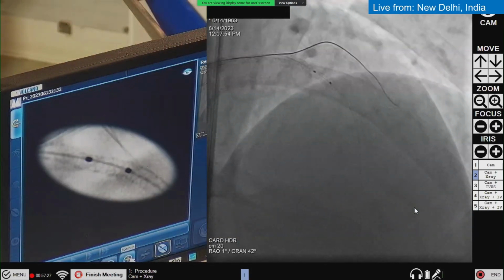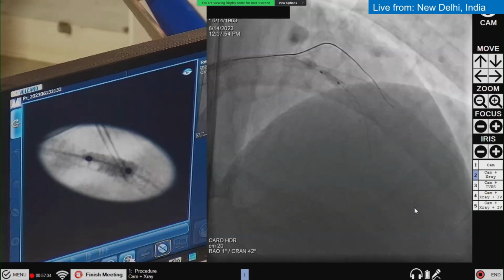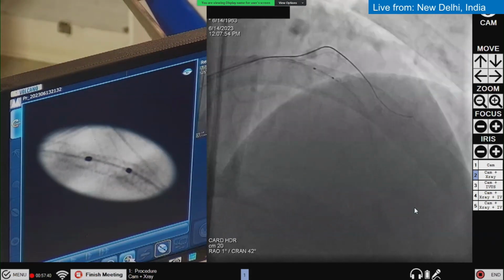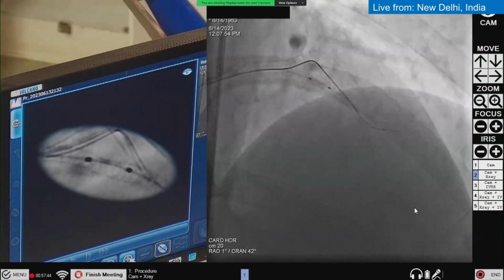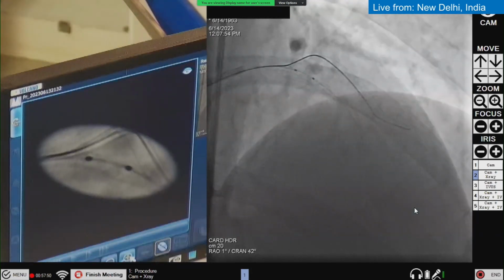Okay, from here. Go up. 1, 2, 3, 4, 5, 6, 7, 8, 9, 10, 12, 14. Deflate. 14, 16.